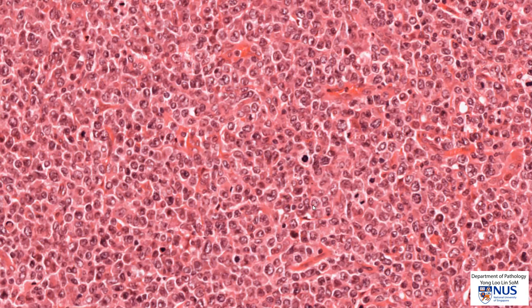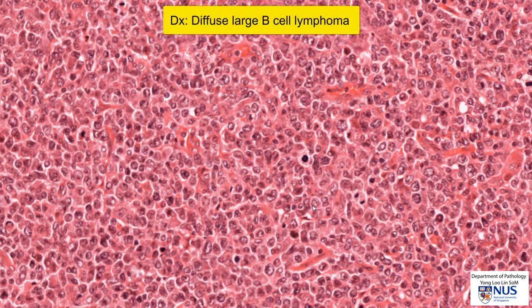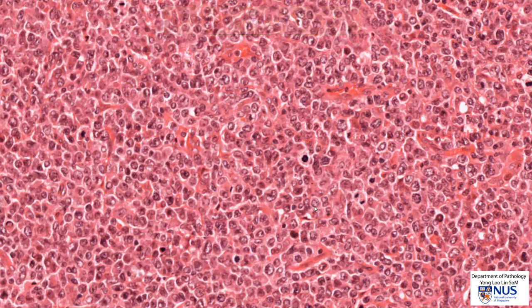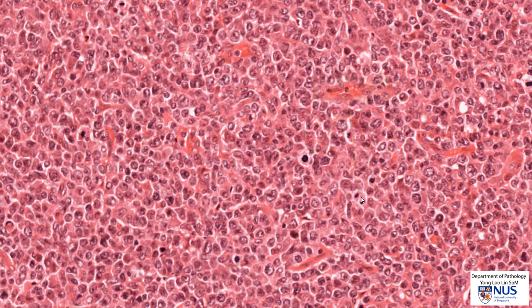Of course, in order to type the lymphoma, we have to do immunohistochemistry and sometimes molecular tests as well. After doing immunohistochemical tests, this turns out to be a diffuse large B-cell lymphoma — one of the commonest types of lymphoma with large cell morphology. Here we can also see quite a few mitotic figures. This is usually an aggressive tumor; however, it may respond well to chemotherapy.